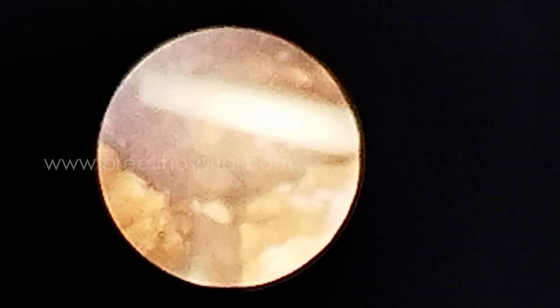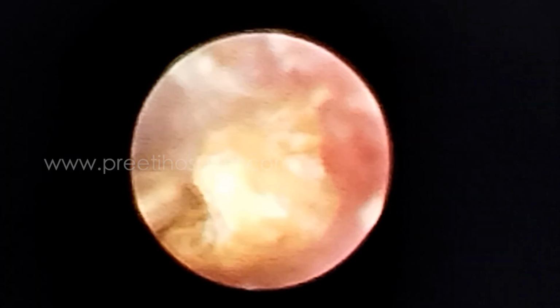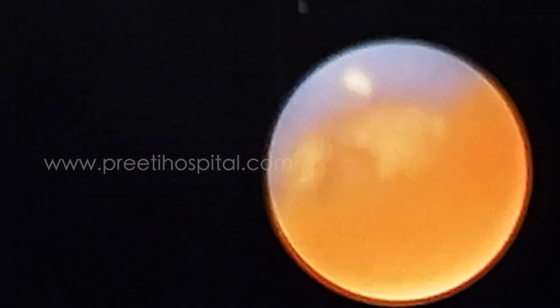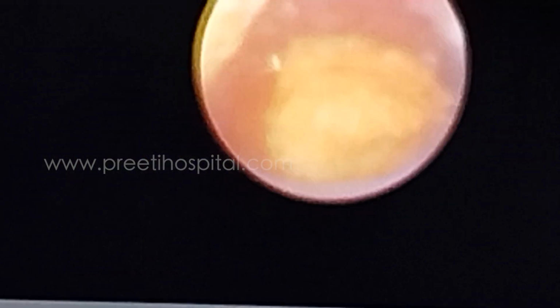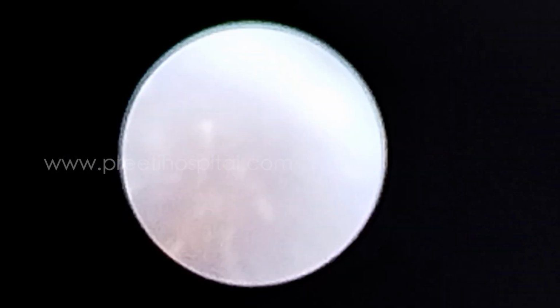You are making the surface irregular and making them into pieces. Small pieces will not break very well with this. Which one? Pneumatic. Large pieces better. Large fixed piece better. Moving piece flush.